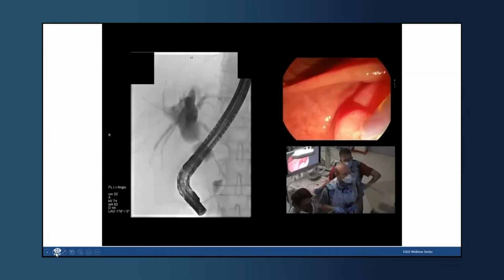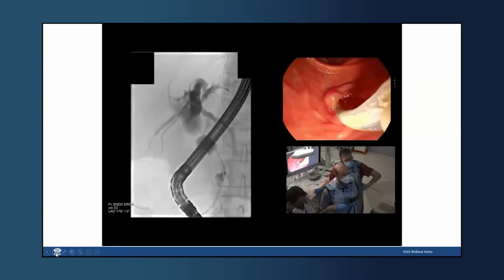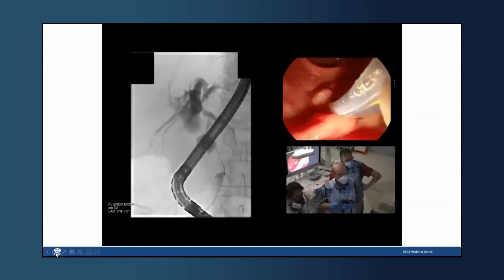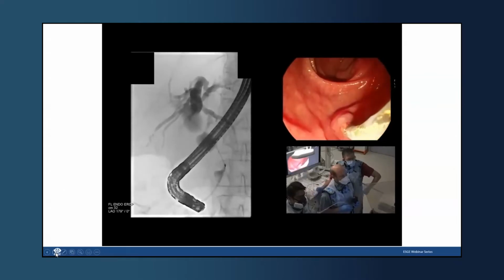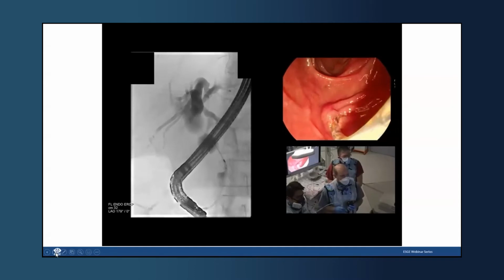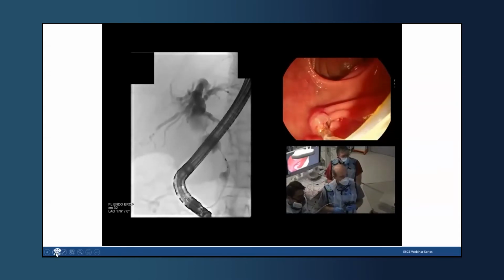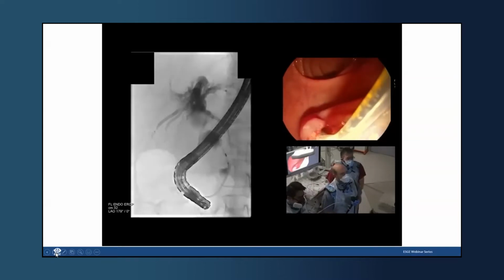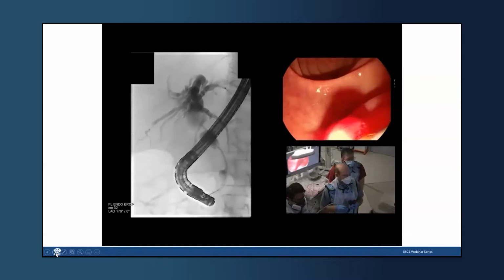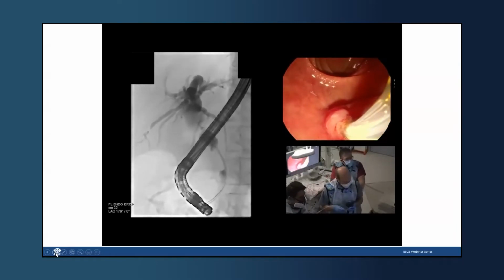Well, low CBD. See if we can drive that through. It's tight, isn't it? It goes around a bit of an angle, doesn't it? There you go, good man. So there's a little bit of an angulation at that point of the stricture. We saw that when you passed your wire, didn't we? It's a very tight stricture. No, that's nicely through.